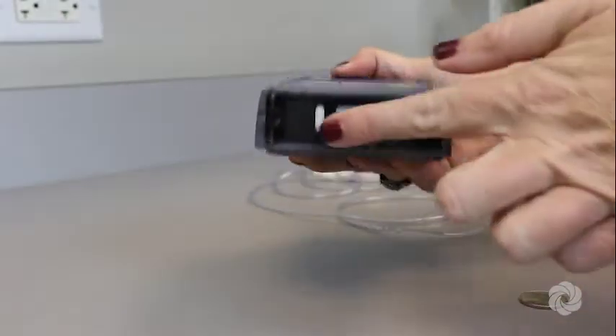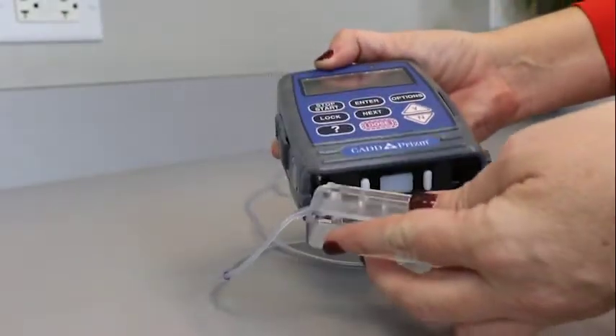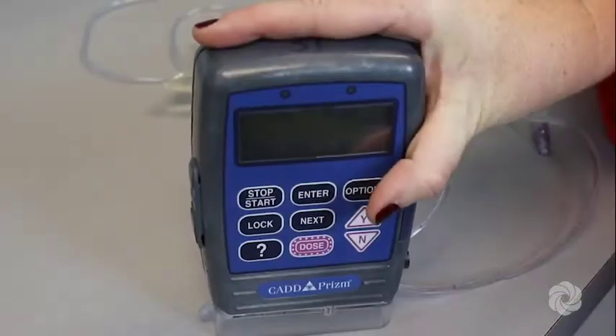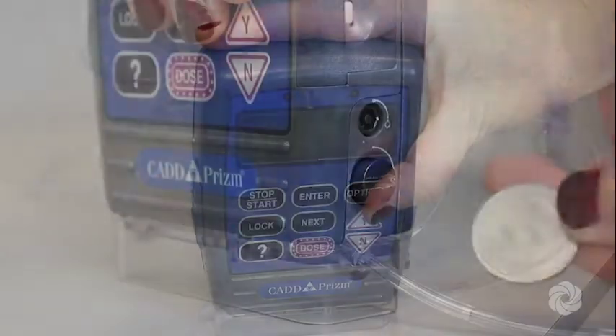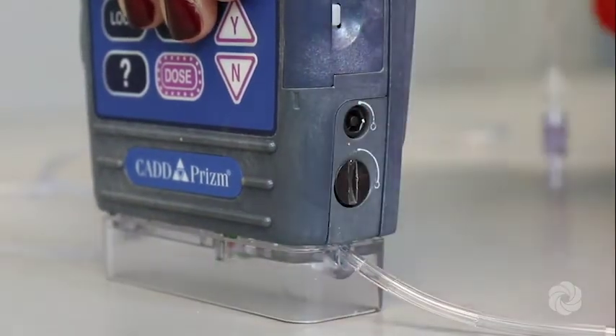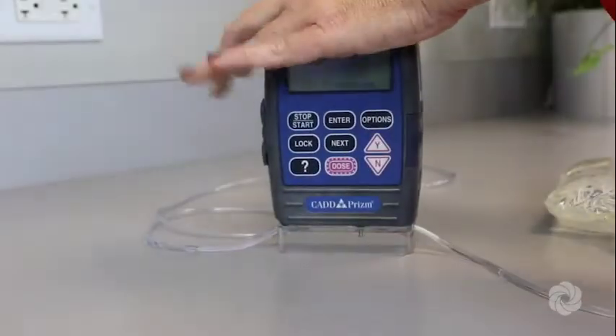Insert the new cassette hooks into the pump's hinge pins. Place the pump on a firm surface and push down on top of the pump. Finally, using a coin or the key provided, lock the new cassette to the pump. You will know the cassette is locked when you hear a beep.